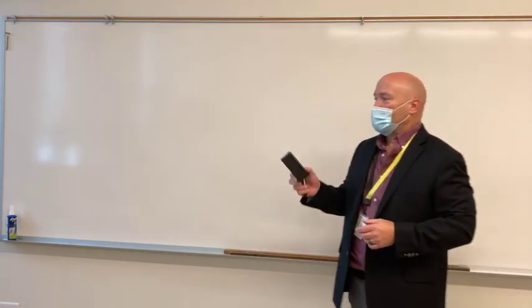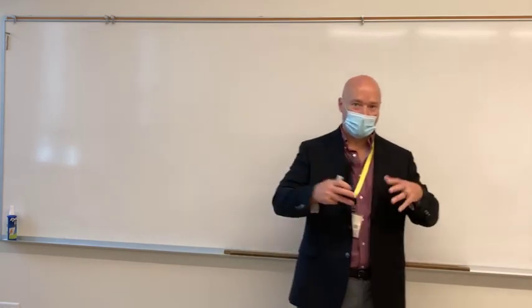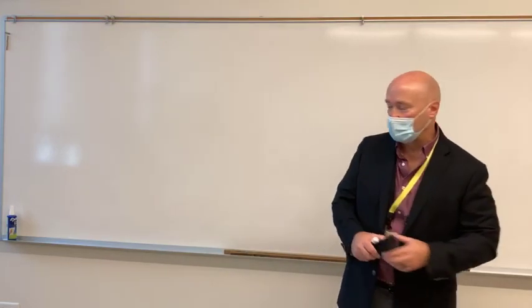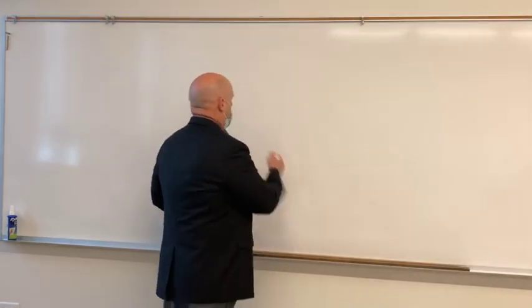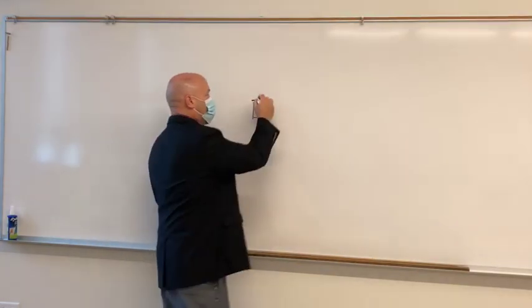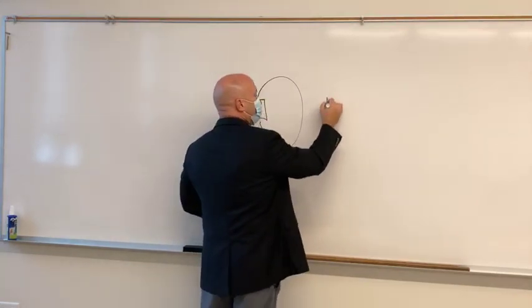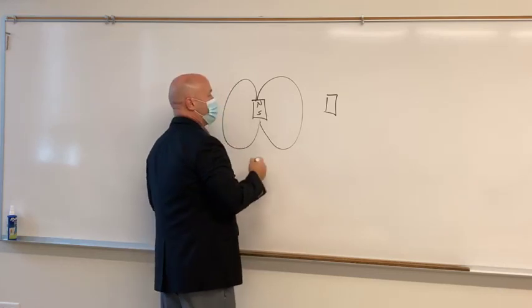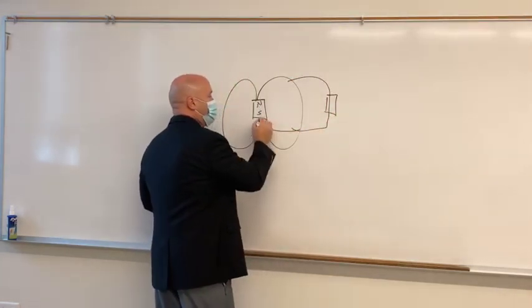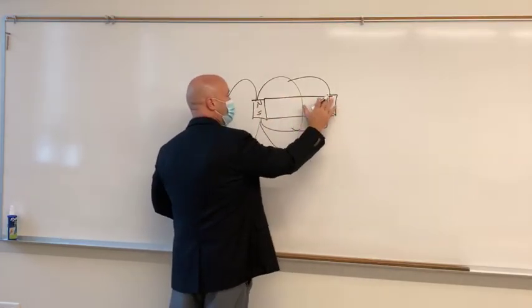So in a magnet, we talked about magnetic induction. Magnetic induction is just induction, or creation, of magnetic fields through something that's ferromagnetic. So I have a magnet here. It's got a north and south pole, and the magnetic field stretches out from one end into the next. If I take a piece of iron and get it close enough, these magnetic field lines will distort and go through that ferromagnetic piece of material and eventually draw it all the way in until the two are touching.